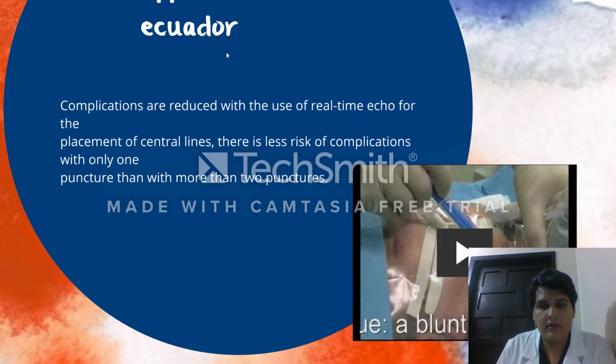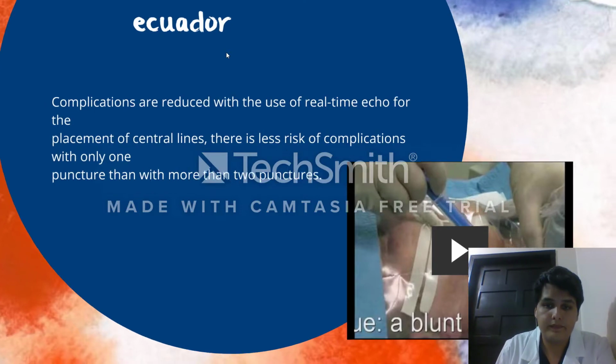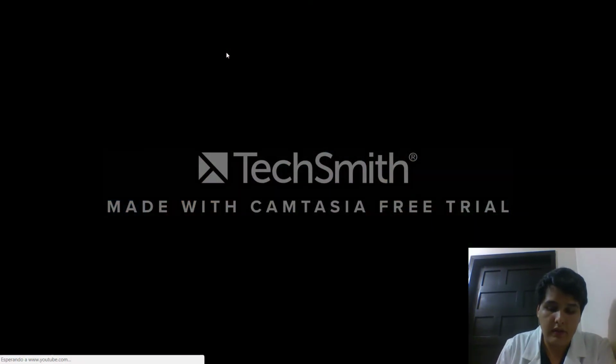So it's the regular, the old technique versus the new technique, and the conclusion was that the complications are reduced with the use of real-time echo for the placement of central lines. There is less risk of complications with only one puncture than with more than two punctures, so it's better with the echo. This is another video of how they do it.